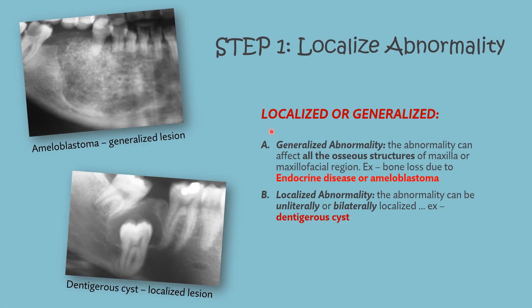If the lesion is generalized, the abnormality can affect all the osseous structures of the maxilla or maxillofacial region — for example, bone loss due to endocrine disease or ameloblastoma. From the picture you can easily see the lesion is generalized, spreading and present in more than one tooth in the mandible. In a localized abnormality, the abnormality can be unilateral or bilateral. In this image you can see it is unilateral and affecting one tooth — this is a picture of a dentigerous cyst, a localized lesion.